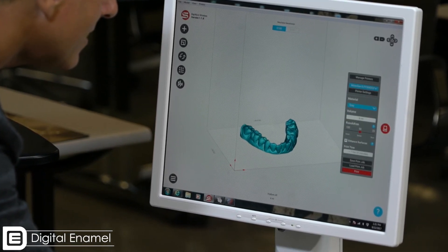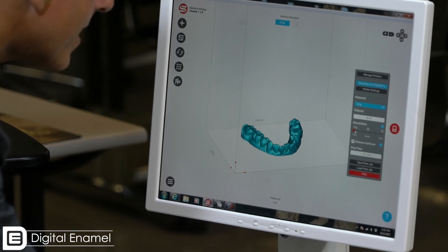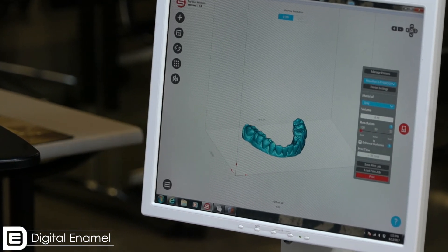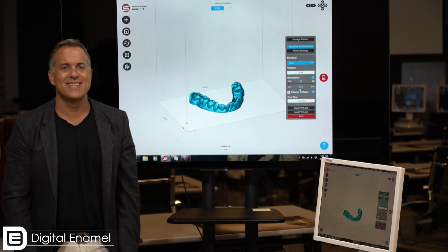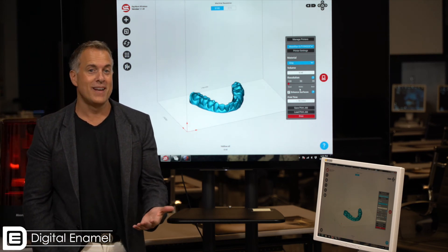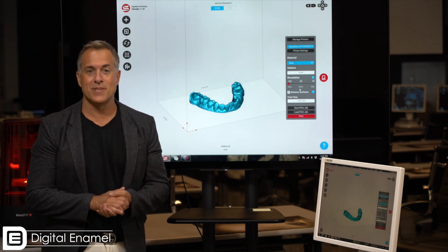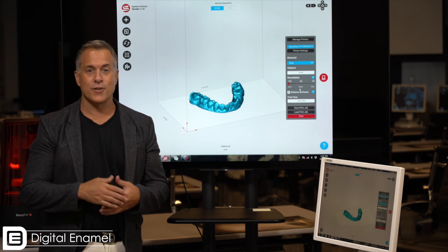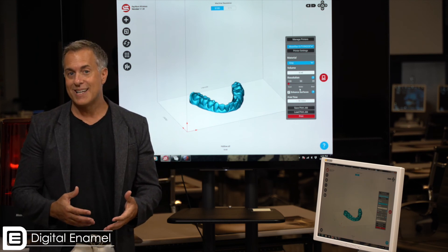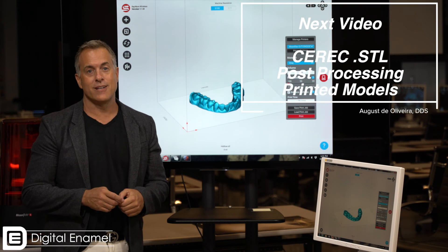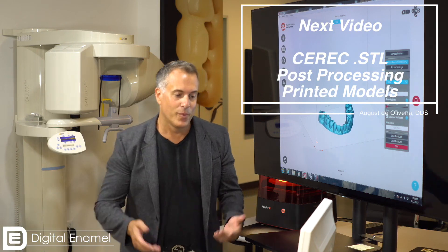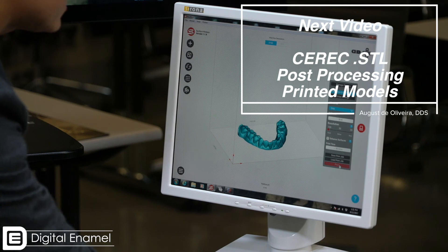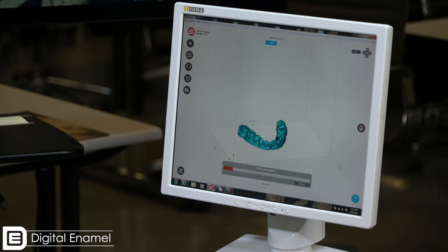Hit gray, put that to 100 microns, and you can see that this is going to print this model in 56 minutes. 56 minutes is really not a lot when it comes to 3D printing a model. Certainly if you were going to pour this up in die stone, you'd probably want it to sit for at least that amount of time. So we just go ahead and hit print and we're off to the races.